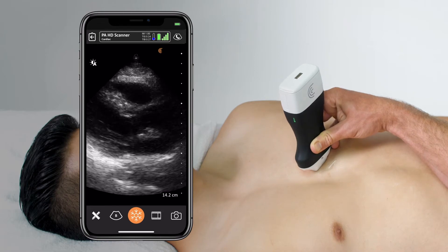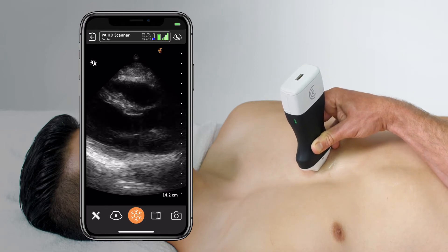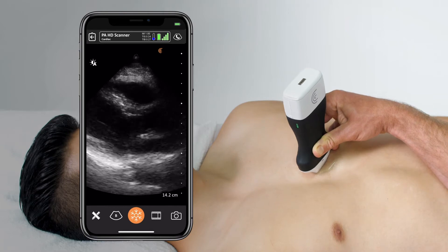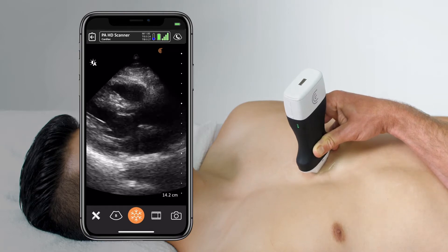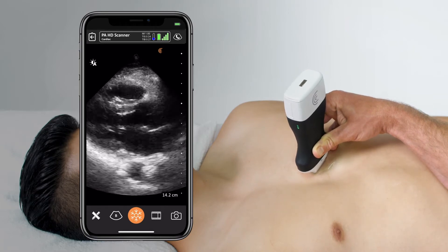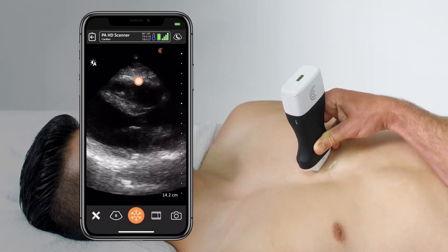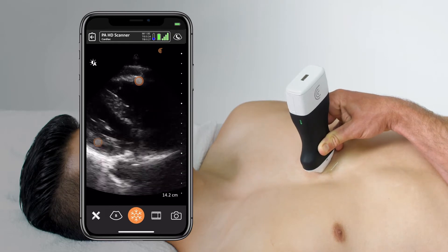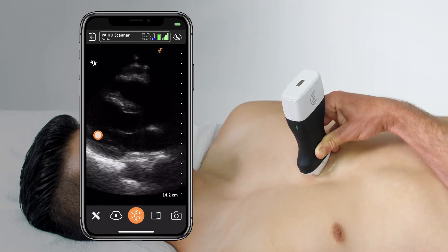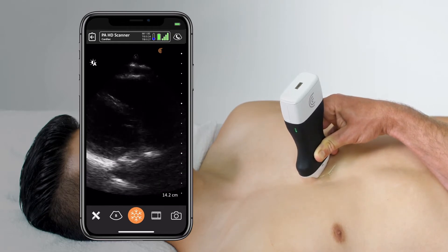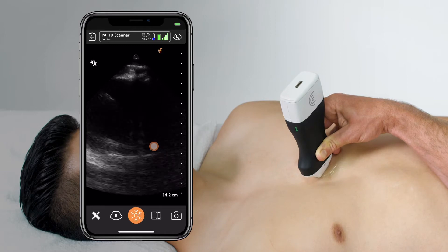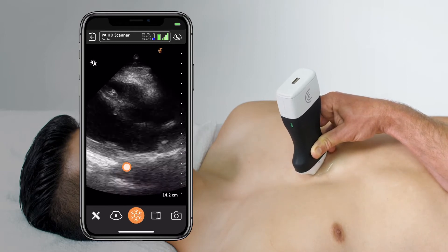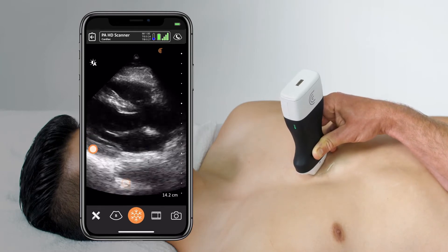When I've found an image that I really like, with a great window, good opening valves, and the widest possible ventricle, I can now identify the different features of the heart. I see the right ventricle at the top of the screen, the left ventricle at the bottom. I see the aortic outflow track and the left atrium, and the descending thoracic aorta behind the very bright pericardium.